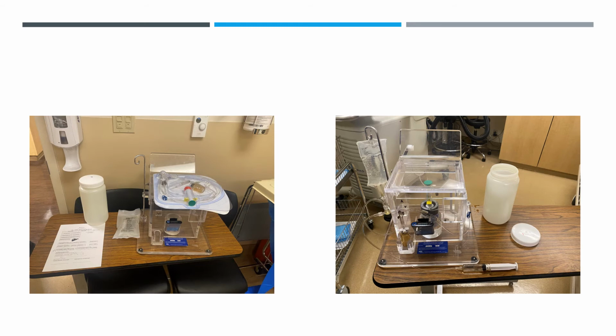And then you press the green cap to completely open it up, and on the other side, I guess you can't see from here, there's tubing that comes out from the gray container, and then it wraps all around, and there's an end. I really wish I could have shown you guys in class, but on the right picture, by the saline, there's a little white hook. That's where the interventional radiologist is going to connect when injecting into the patient. It's all such intricate stuff. But let me go back if I can.